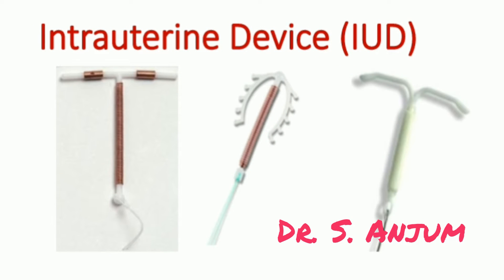IUD, also known as intrauterine device, is a contraceptive method which is widely used nowadays. It is mainly used as a long-term contraceptive method.